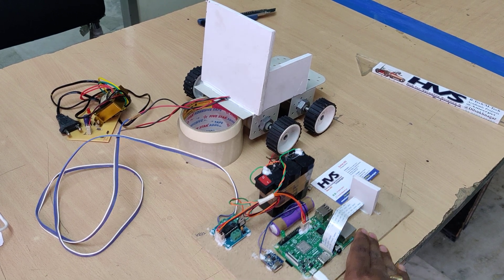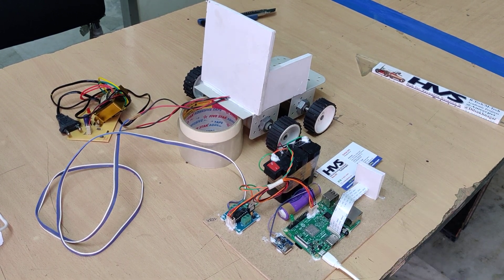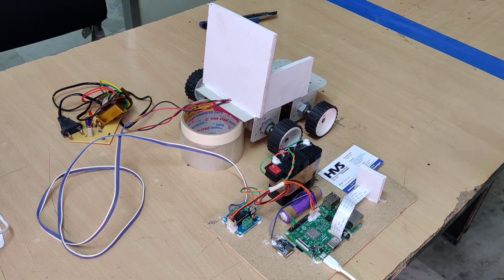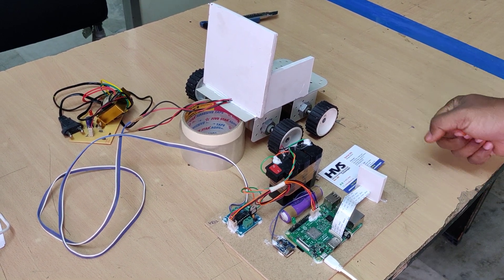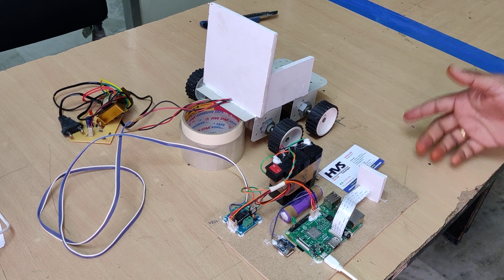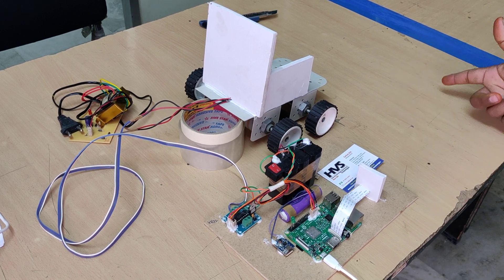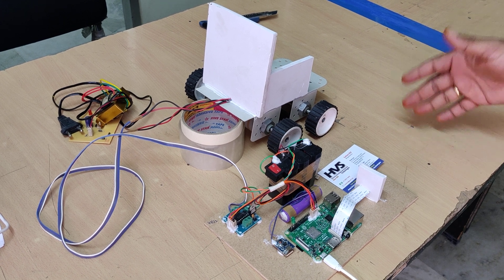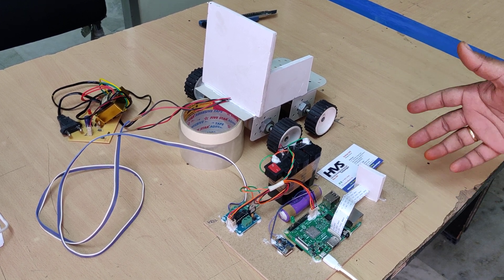Welcome to the project demonstration of hand gesture controlled wheelchair. Here we are going to detect hand gestures — finger counting — so whenever we show fingers in front of the Pi camera, like one, two, three, four, we are going to detect them. The program is coded on the Raspberry Pi.